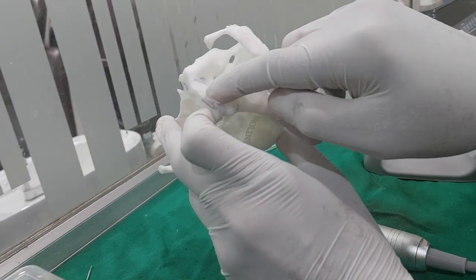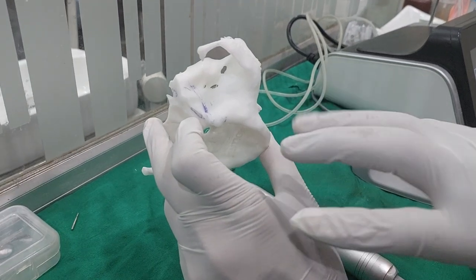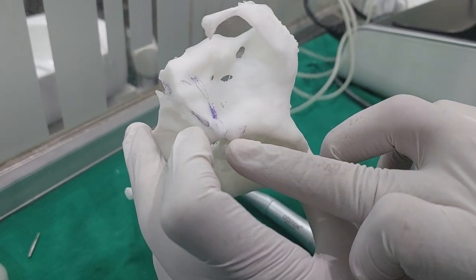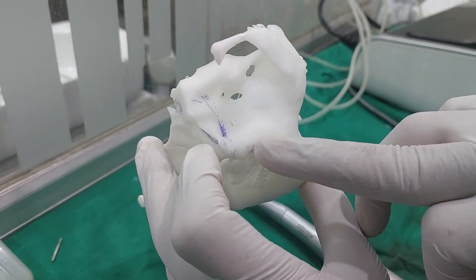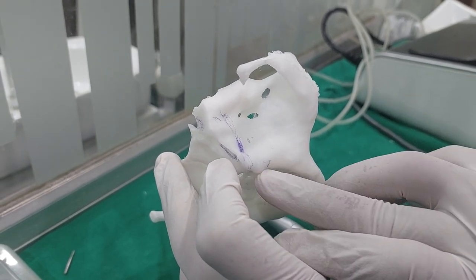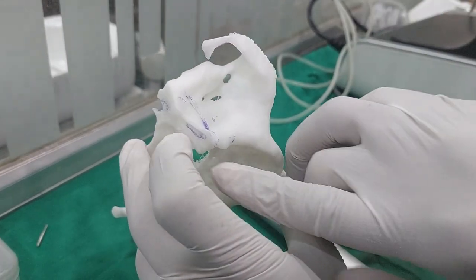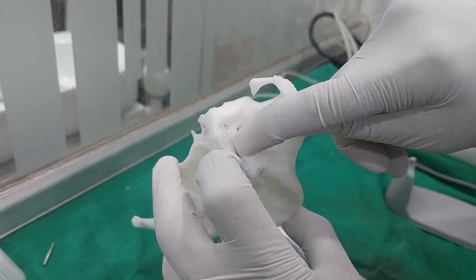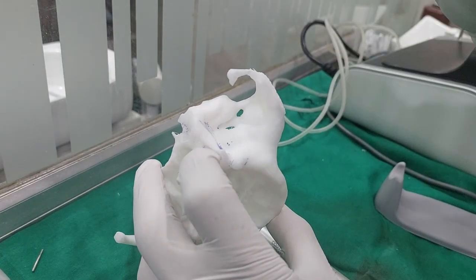After passing through the posterior wall of the sinus, we will reach the pterygoid bone. Different clinicians take different points of entry - some from 4 mm, some from 5 mm, some from the tuberosity. If you take 4 to 5 mm, you will get more implant length passing through the tuberosity. The key is under-preparation, because this bone is very soft. When you reach the cortical bone, you have to pierce it. If the implant tip comes between the fusion zone there is no harm, and if it is anchored to the fusion zone there is no harm. Even if you get primary stability without anchoring to the bone, that is also acceptable.